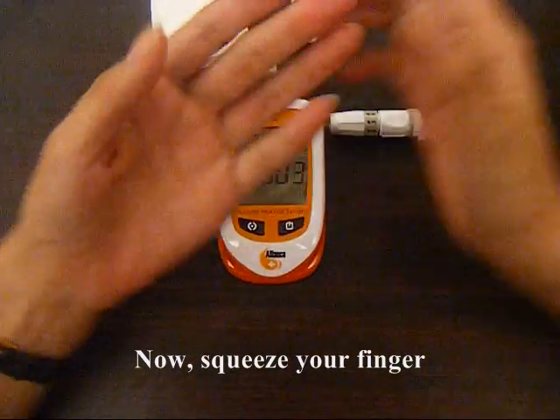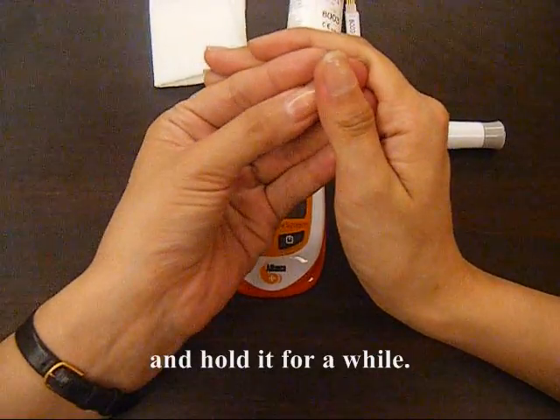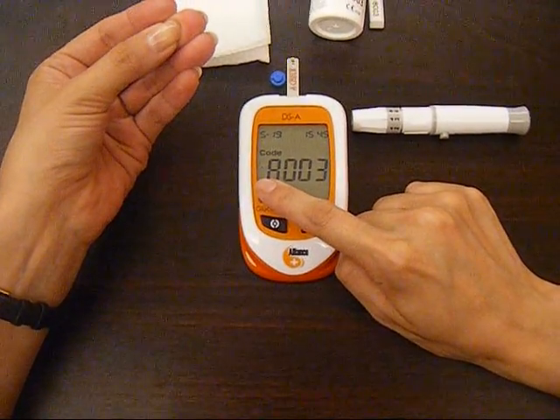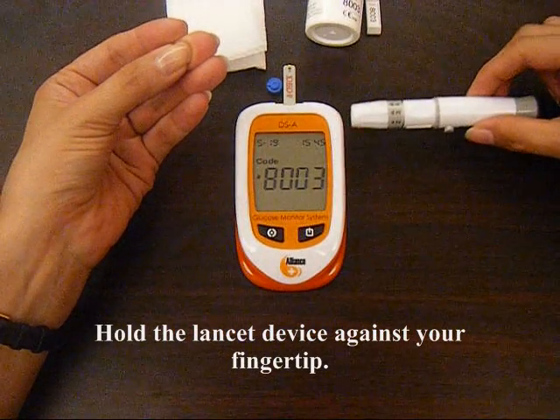Now, squeeze your finger and hold it for a while. When you see the blood icon flashing on the meter screen, hold the lancer device against your fingertip.